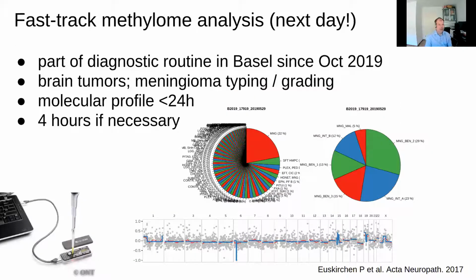Now, I'm going to switch gears a bit, because now we were talking about microarray analysis, and microarray analysis, as you probably know, is a slow process. And this process is too slow for clinical practice. In fact, it's much slower than histology. It's much slower than immunohistochemistry. It's even slower than sequencing and FISH.